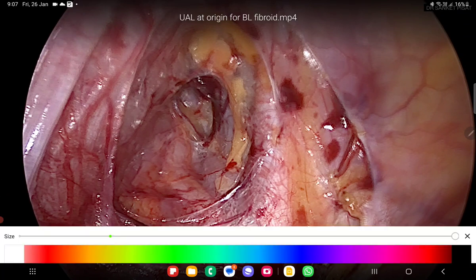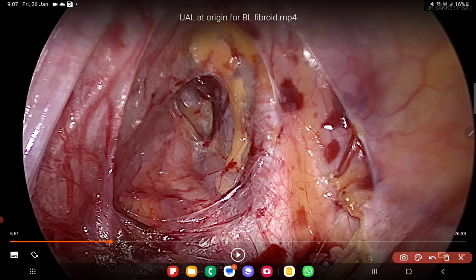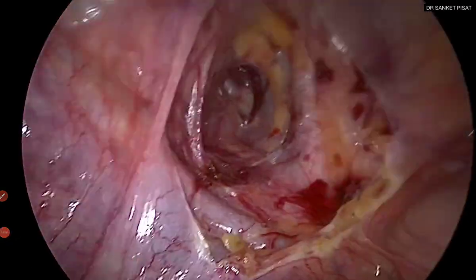The vital structures we can now identify: the external iliac artery is seen here, and below it, covered with fat, is the external iliac vein — which is posteromedial to the external iliac artery. The ureter is expected somewhere here. The external iliac artery and vein are on one side, and the ureter is on the other — but they are not at exactly the same level. The ureter is slightly deeper than the external iliac artery and vein, so one has to go a little bit deeper to find it.